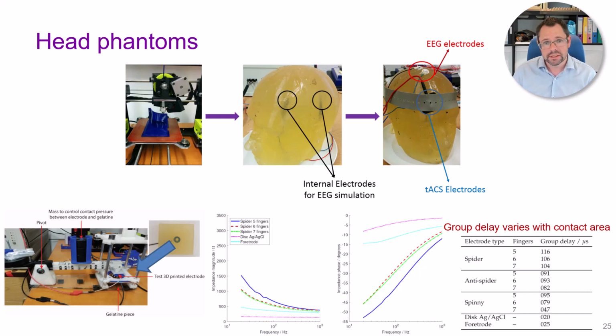And then lastly, it's not directly related to putting electrodes on a person, but there's lots of interest now in making phantom devices to let us do more controlled testing of novel electrodes and novel instrumentation. If we're making, say, a neurofeedback system, we can simulate it. We can put electrodes on a phantom head.